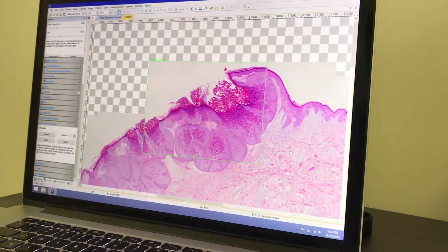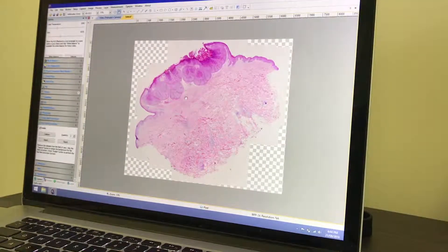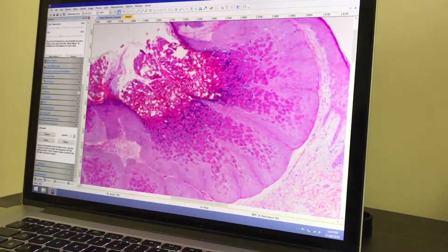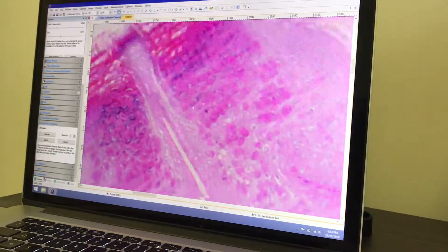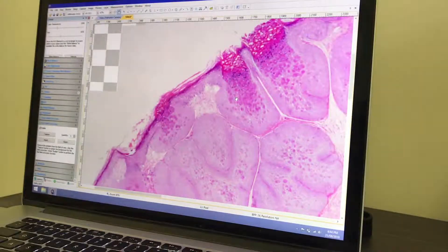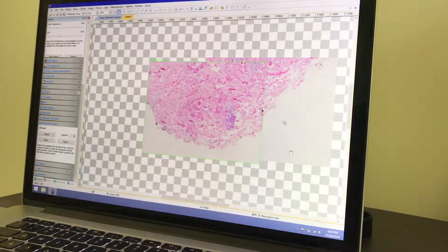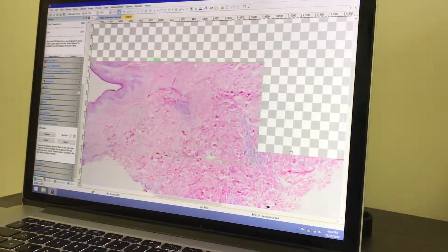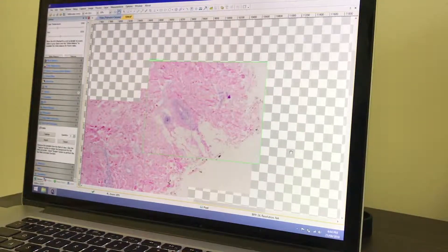Once you've covered all of the tissue area, just click the Stitch button again to end the process, and your final composite image will be shown. This recording is being shown in real time, so this is the speed at which you can expect to capture on an older PC such as mine. You'll notice as I'm moving across the specimen, there is a green rectangle around the current frame, and this tells me my computer is keeping up with the speed I'm moving the stage.